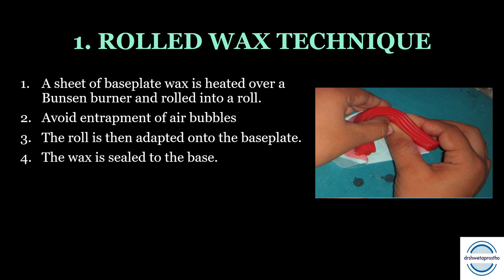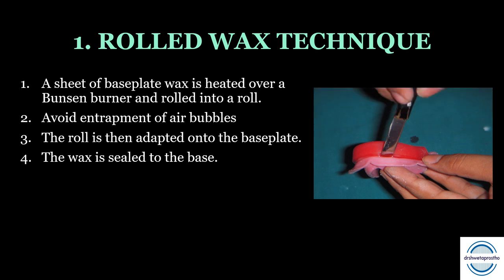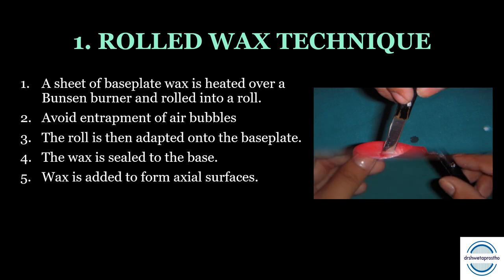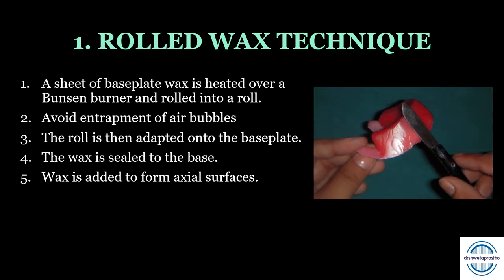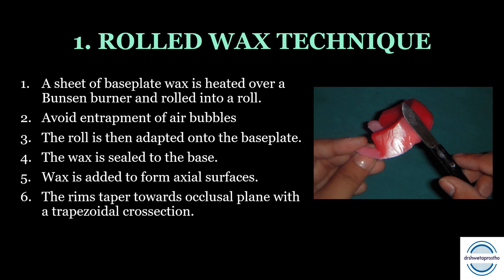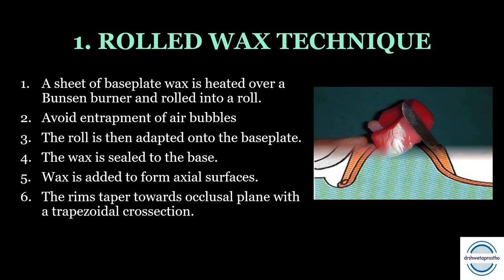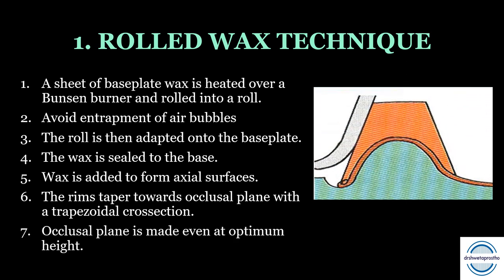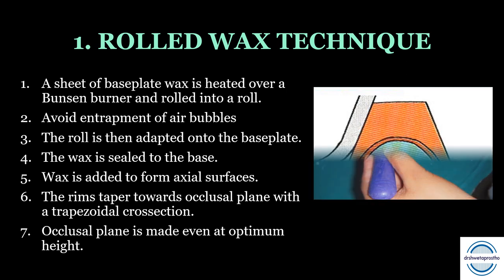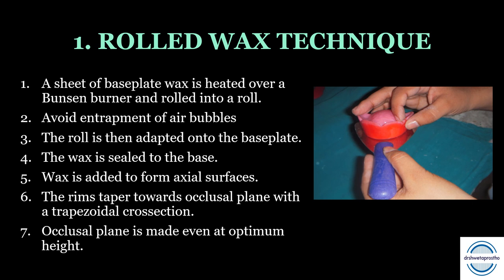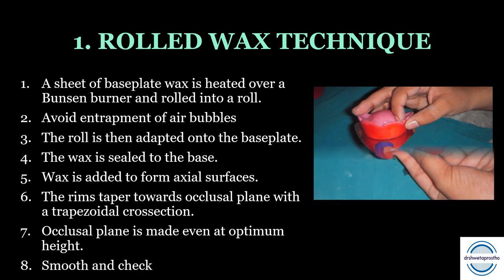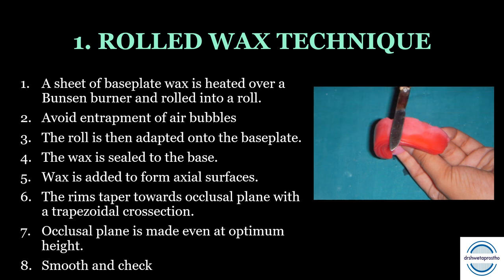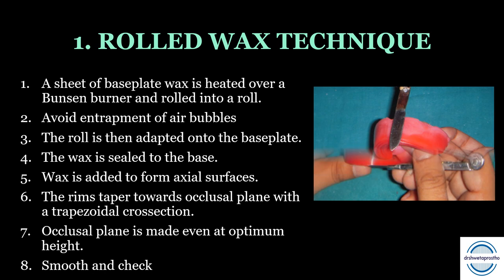The wax is then sealed to the base plate with a hot spatula or the curved end of a wax knife. Wax is added to form the axial surfaces — the labial and lingual surfaces — and the rims should taper towards the occlusal plane with a trapezoidal cross-section. The occlusal plane is made at the optimum height using a hot plate, then smoothed to eliminate any roughness, and finally the dimensions are checked.